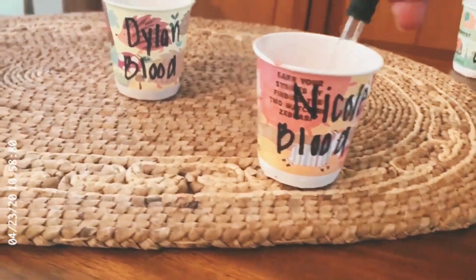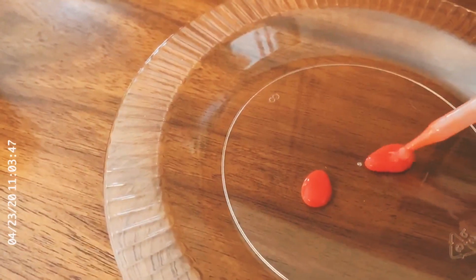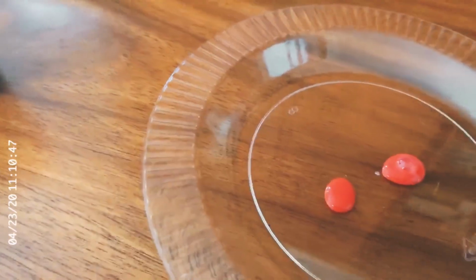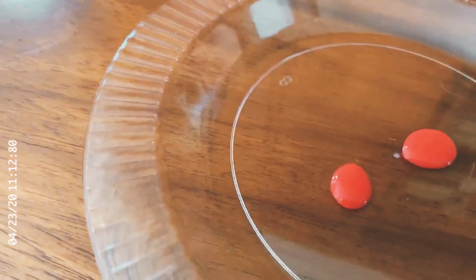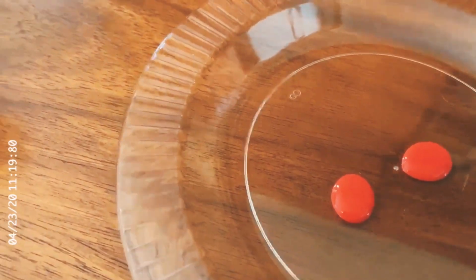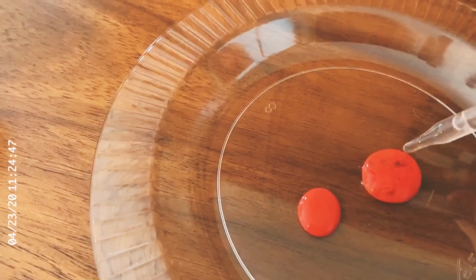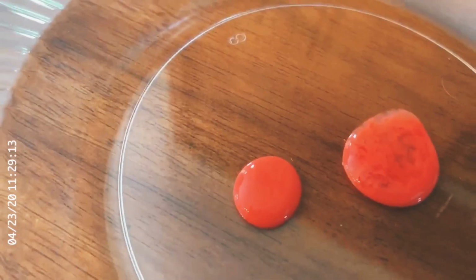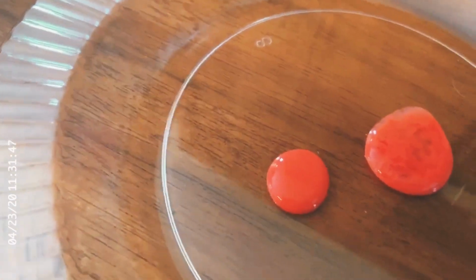All right, Nicole is next. We're gonna get Nicole's sample, put it on our plate, try not to make a mess. Oop, that was a big blood drop. I'm gonna go ahead and grab Nicole's anti-A and anti-B. Anti-A is first. Anti-B is next. We're looking, we're writing down positives and negatives. Positive is clotting, negative is not clotting.